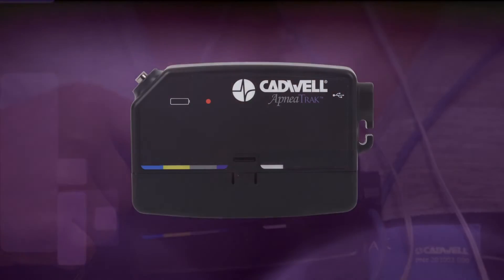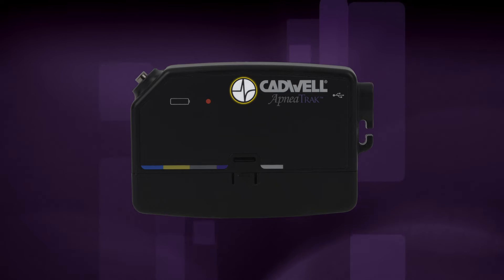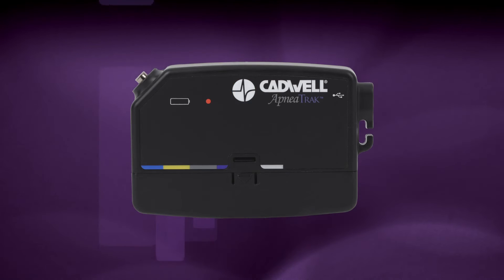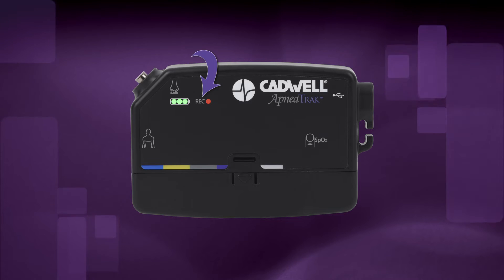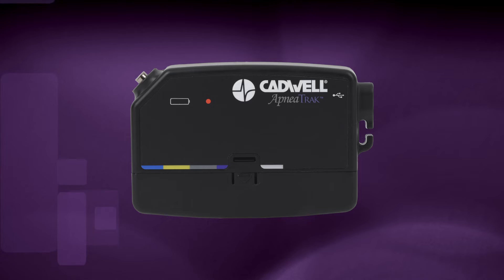If your provider instructed you to hold the button to start the recording, press and hold the raised Cadwell logo event button for three seconds until the recording REC indicator LED on the apnea track appears. The LEDs will then turn off, but the recording has been activated.